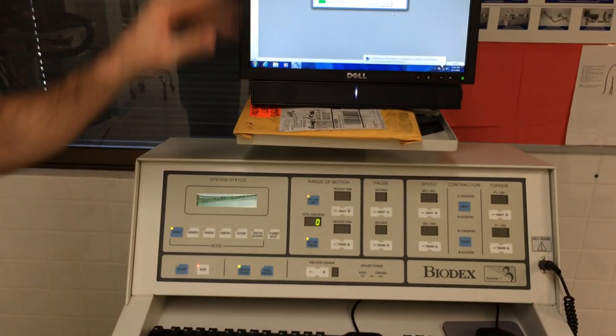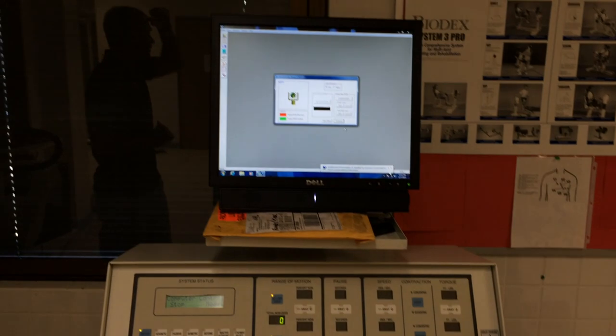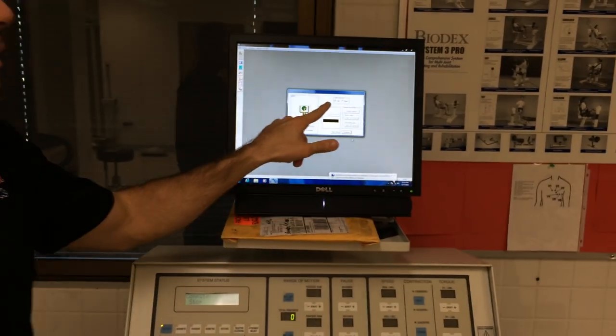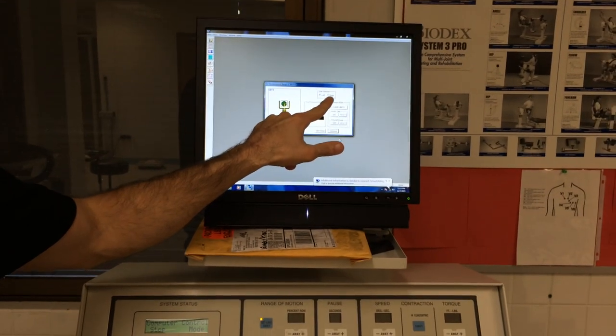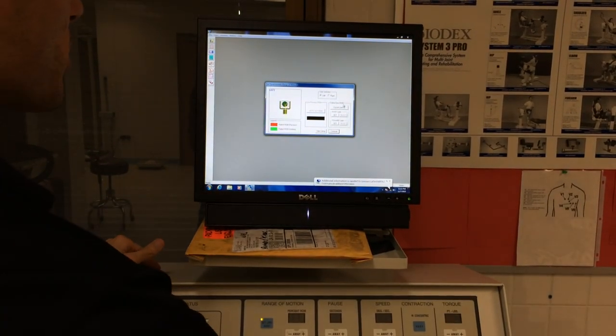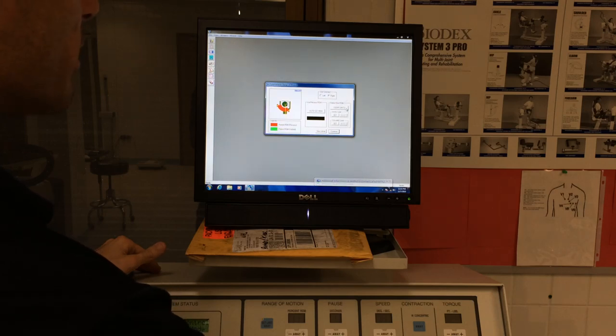It'll now light up green. It'll automatically take us to the next screen. We want to make sure first we're doing the right side. You see it defaults to the left. We're doing Bo's right, so we want to make sure we have the right side picked. And then we're going to hit this clear limits button.